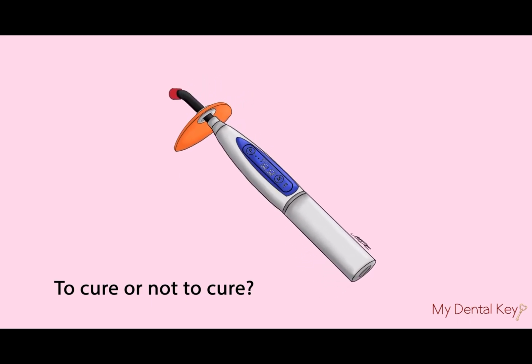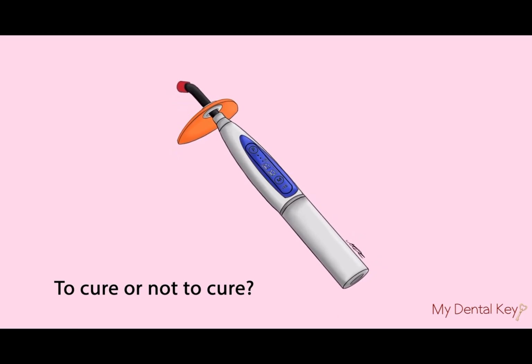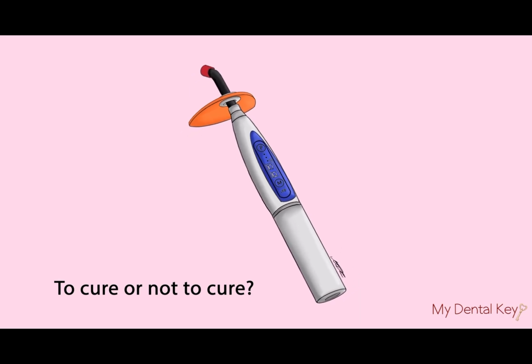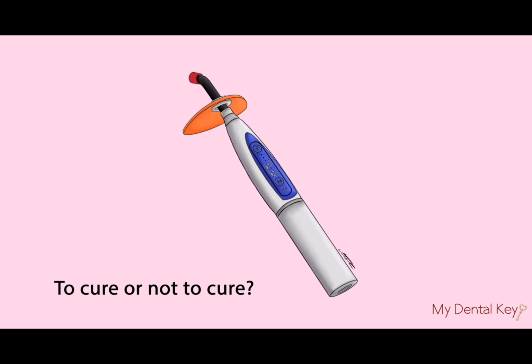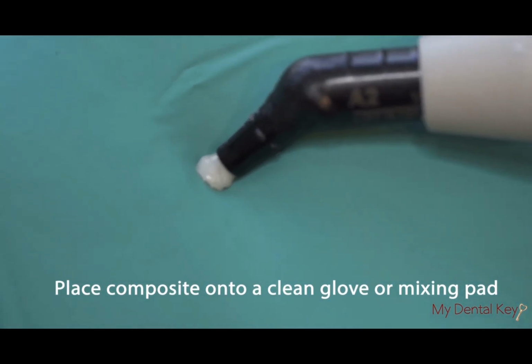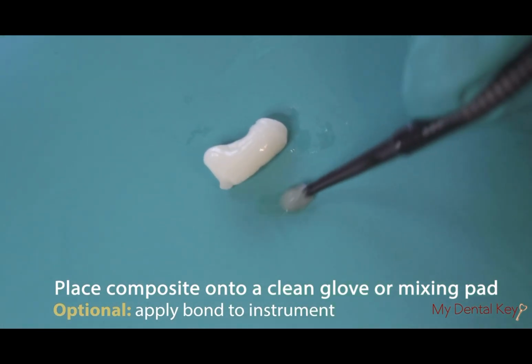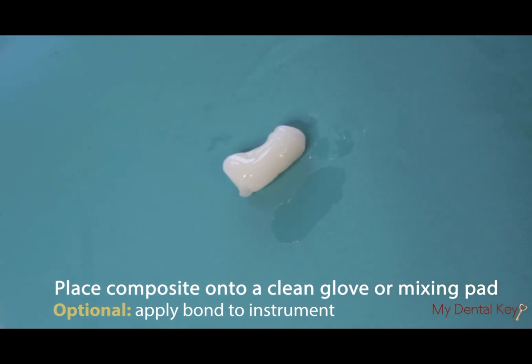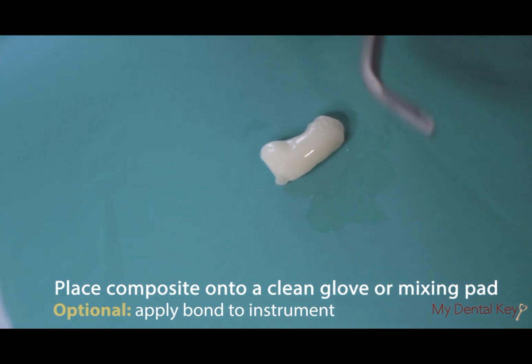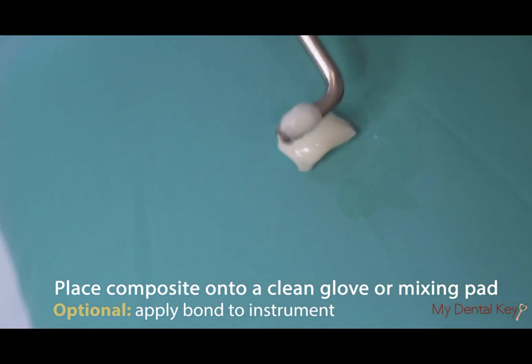However, we found that when working with the typodont teeth, it was helpful to leave the bond uncured. Doing so helped the composite flow into the preparation. Extrude packable composite onto your glove or a clean mixing pad. Optionally, you may apply a coat of bonding agent to the hand instrument to prevent sticking of the composite to the instrument. Use a clean hand instrument to pick up a small amount of the composite.